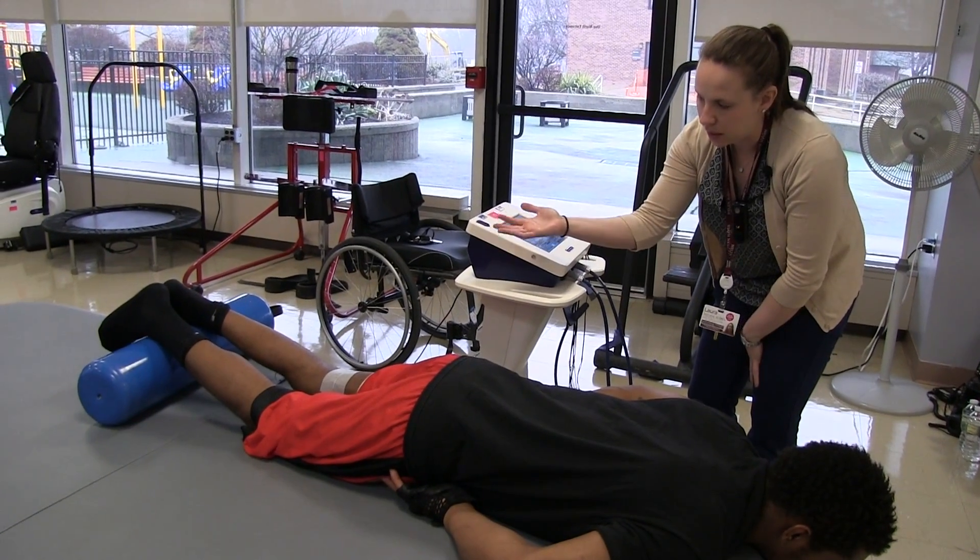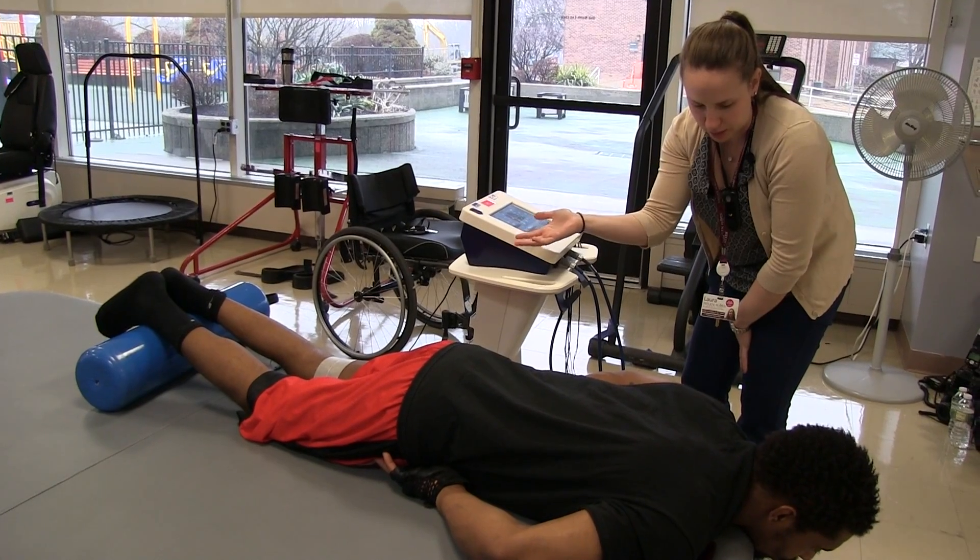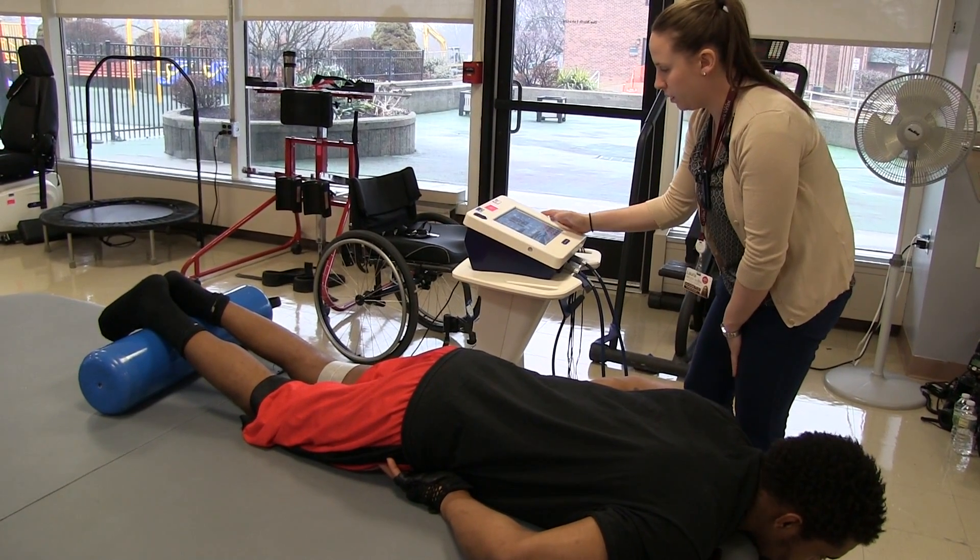We start to contract and start to lift the leg up. Eccentric means you're going to try to lower it slowly back down, okay? Alright, ready?